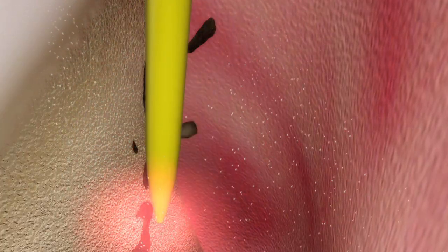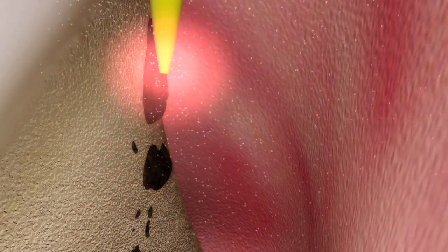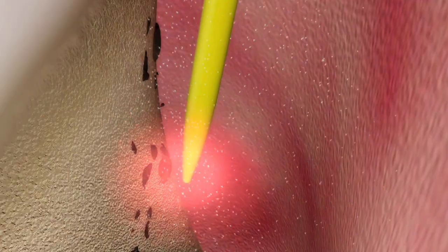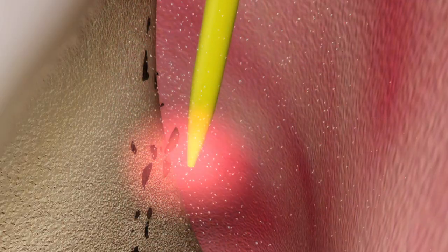The Erbium YAG laser energy allows you to just tap it off. Not only does this step remove calculus, it also decontaminates the root surface and removes the endotoxins that will otherwise interfere with proper healing.